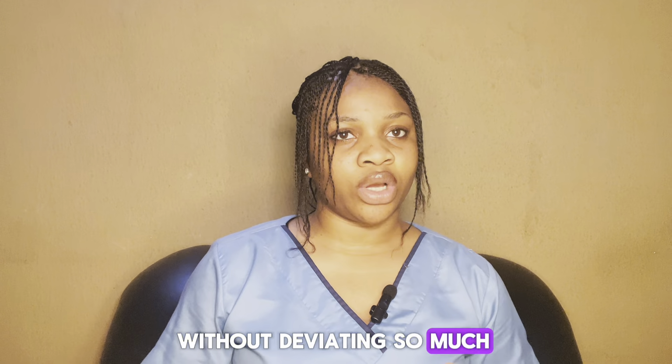Yes. Now let's talk about the purpose of IV cannulation. As we all know, it is to administer IV fluids and medication, for repeated blood sampling, to administer blood and blood products, and also for chemotherapy and others. So now the process of IV cannulation. The IV cannulation process is divided into four different steps, which are explanation and consent, preparation, procedure, and documentation. You can also add aftercare.